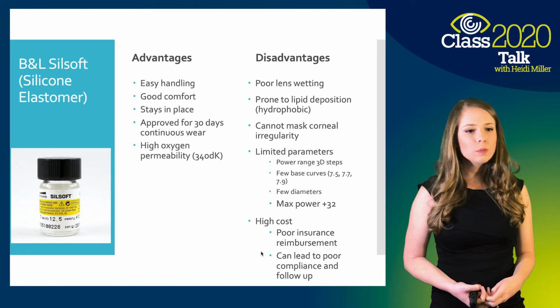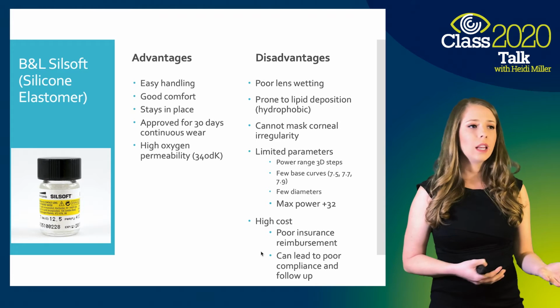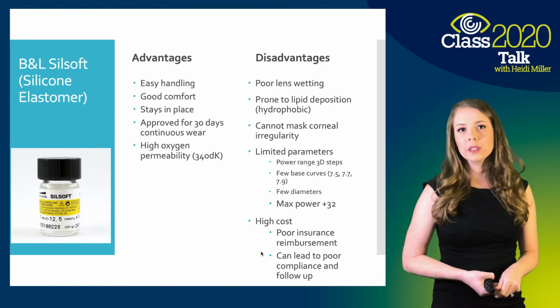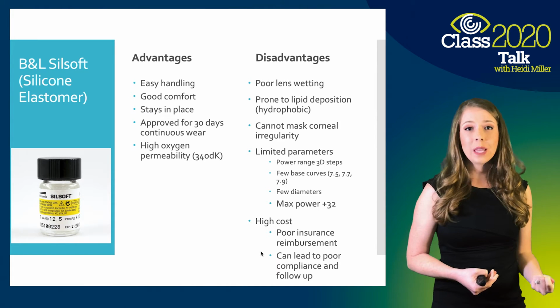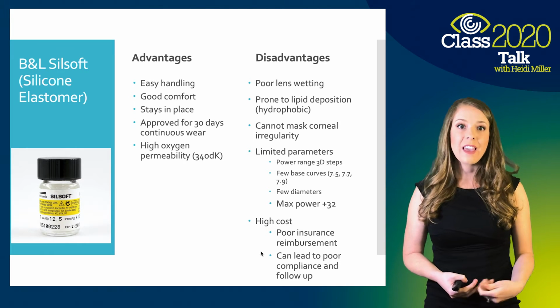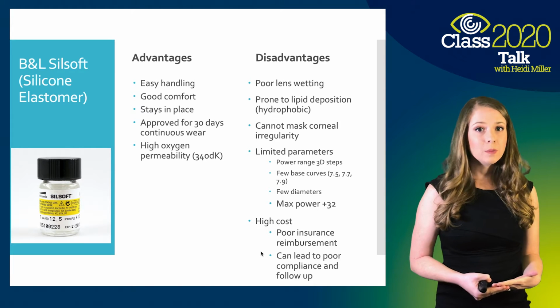With insurance, reimbursement may not be great. And some insurances, depending on what insurances you do take, only cover X amount of lenses per year. So if this patient is prone to losing lenses and it starts becoming an out-of-pocket cost to the parents, it can get expensive. And then now we're facing a barrier with compliance. So keep that in mind as well.